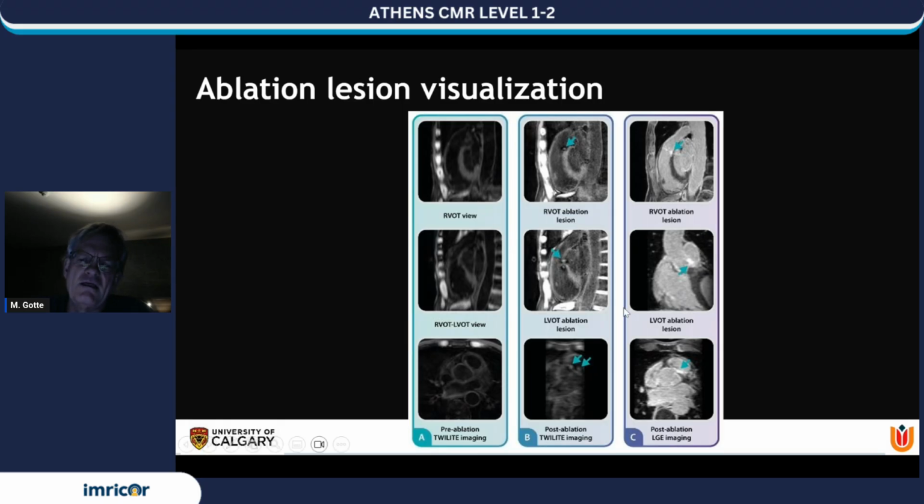of edema. Everyone knows that if you ablate, in the first couple of minutes after the first ablation point, there is edema, so there's swelling of the tissue, there's more water content. It influences your ablation, but it also influences imaging.